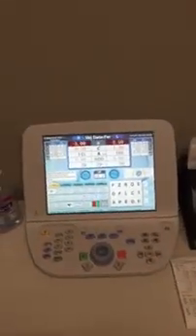Okay, so hopefully this little tutorial will help you guys out a little bit as far as using the Topcon Phoropter and using it in conjunction with the autorefractor, getting the auto Ks, the auto lensometer, and transferring it over to our software, Revolution.